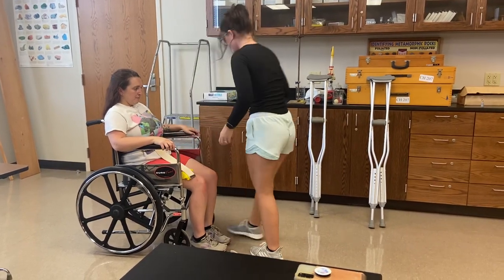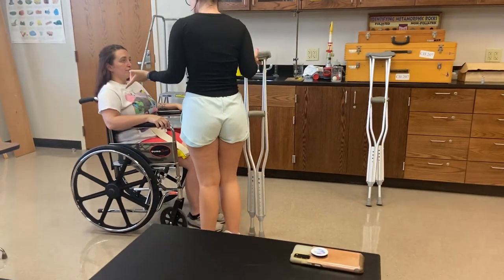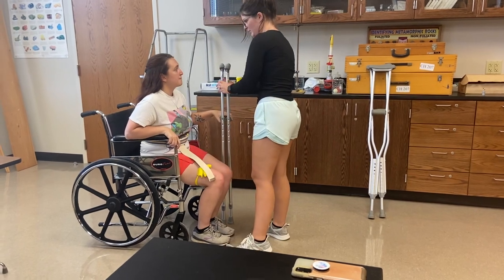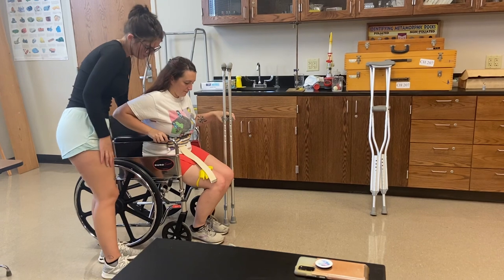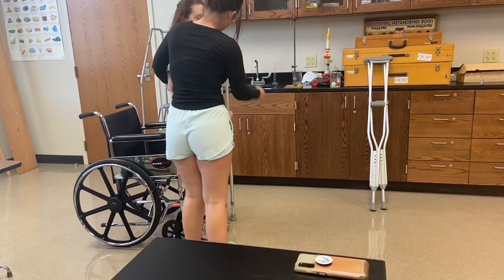So first we're going to measure you for some crutches. If you could just push your back into the back of the wheelchair and scoot forward. Then you're going to grab onto these with the metal part. I'll have you push up with this arm and I'll help you on the count of three — one, two, three. Feel right? Yes.